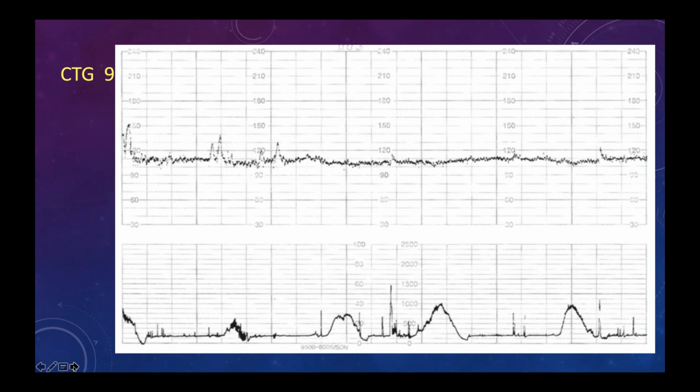And you, next person. Ma'am, may I try? Yes. So Amita, now you understood how to calculate baseline and variability. Yes, ma'am, it's very clear.